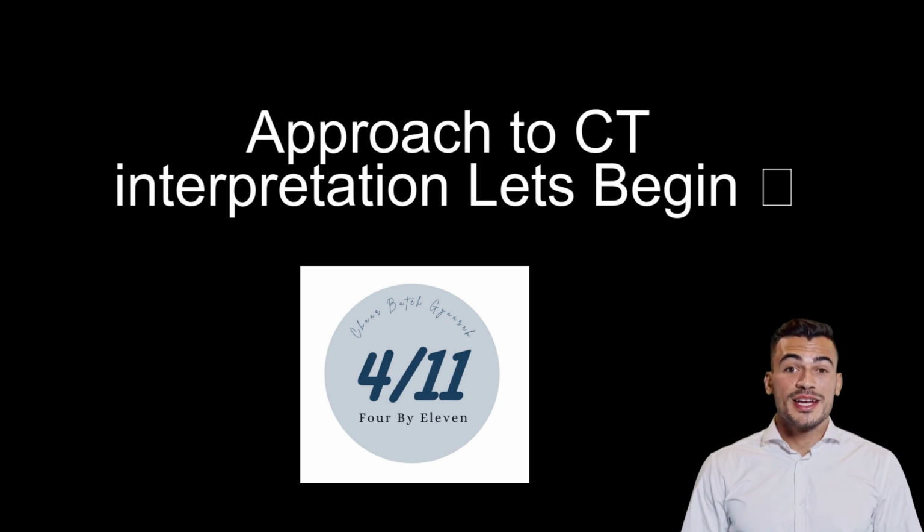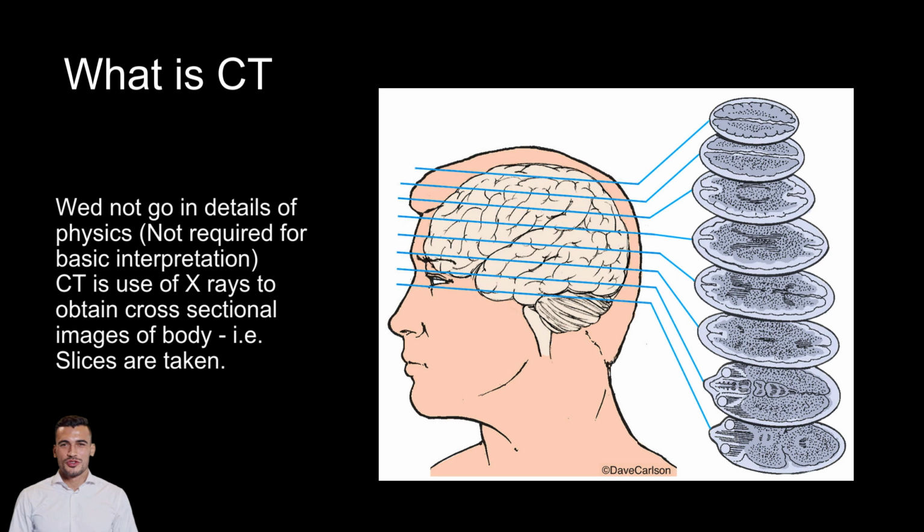Hi guys, today we are going to talk about approach to CT interpretation. So let's begin. So what is CT or computed tomography?